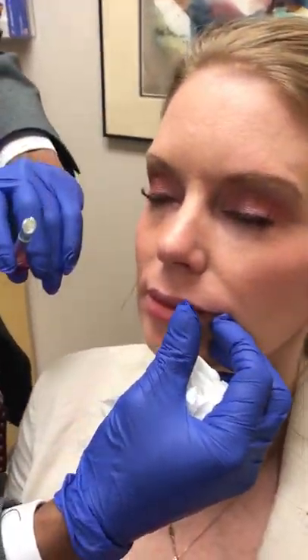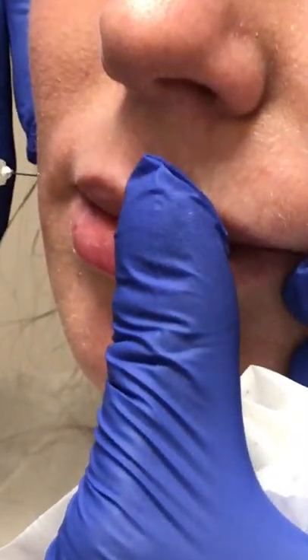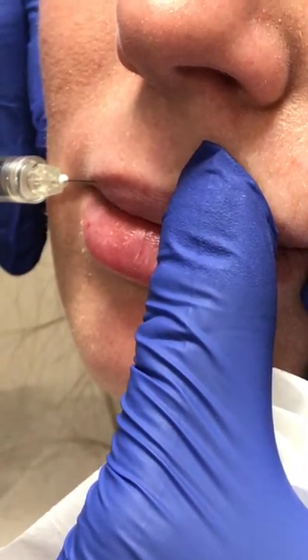How do you like the volume? I'm going to give you a little bit more in the upper area here. I can accentuate even the cupid's bow and the line. The lip can be a little more sensitive than under the eyes because the skin is thicker, so it doesn't absorb the numbing cream as much. We can use a numbing shot sometimes to numb that area as well.